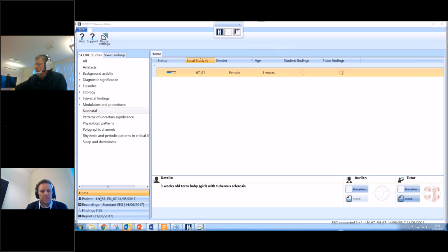But this for sure is something that is interesting, and we have also now a search tool that is under development, and there we will use this type of format, for example this JSON format. So that would in the future also be possible, but not directly now.